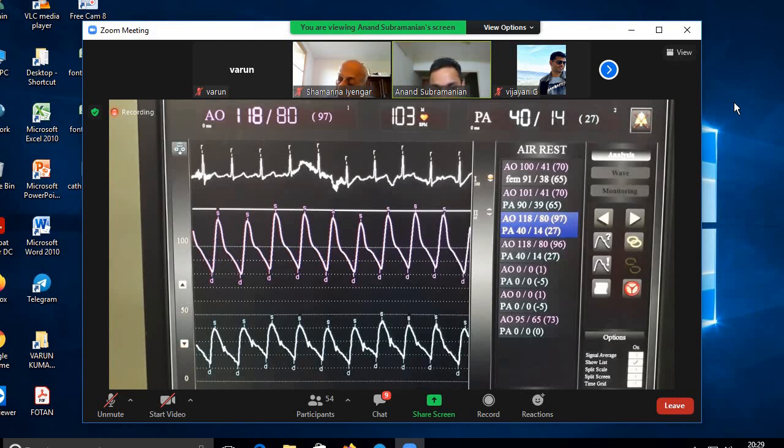You might think that the PA pressure is very high even in a moderate sized ductus, but it might not be. So preferably get into one of the distal pulmonary arteries, either the right or the left. Now, if you're looking at saturations again, because the PDA is angulated more towards the left pulmonary artery, you might actually have a higher PA saturation. So you can't just take an LPA saturation and use it for your PV minus PA when you're calculating the oximetry. We don't routinely do that anymore with oximetry for PDA calculation.